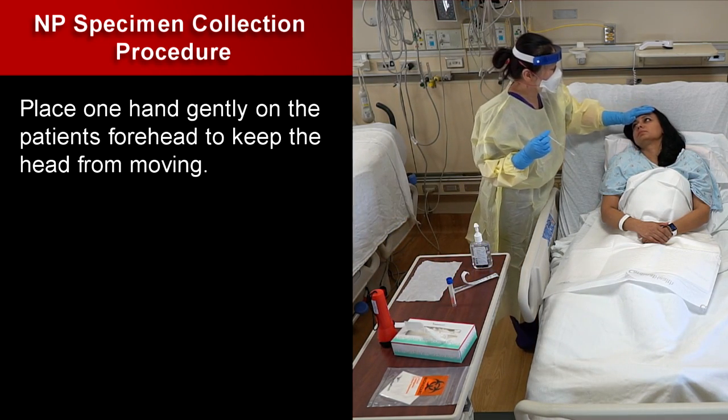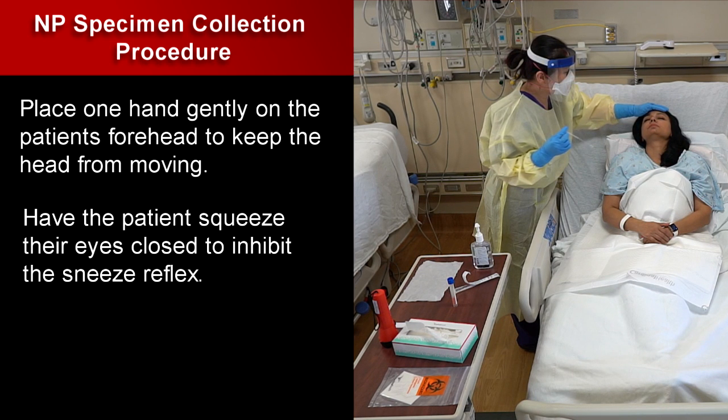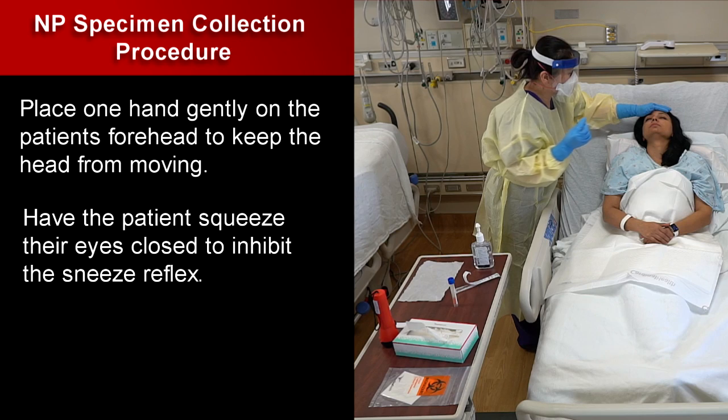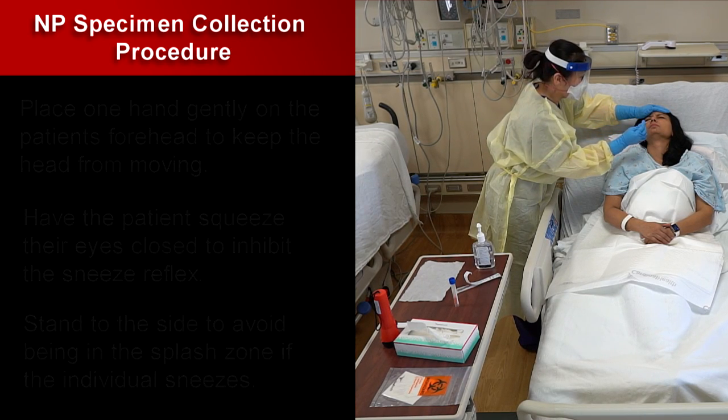Place one hand gently on the patient's forehead to keep the head from moving. Have the patient squeeze their eyes closed to inhibit the sneeze reflex. Stand to the side to avoid being in the splash zone if the individual sneezes.